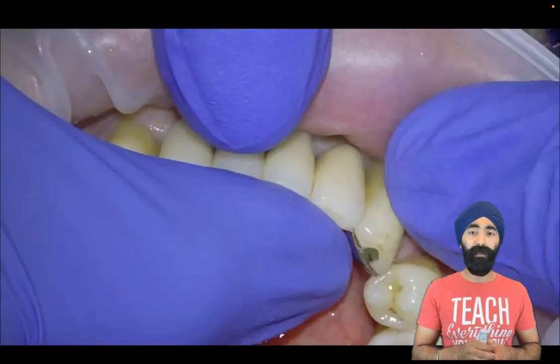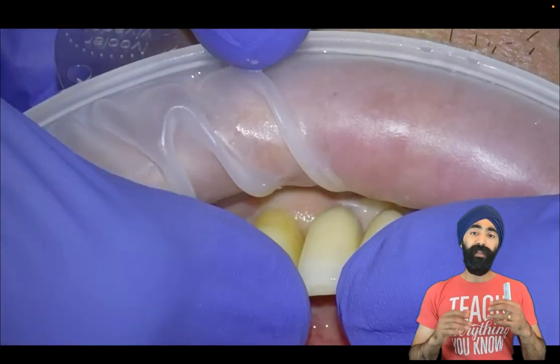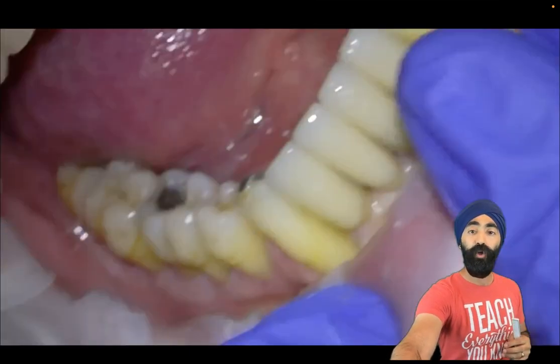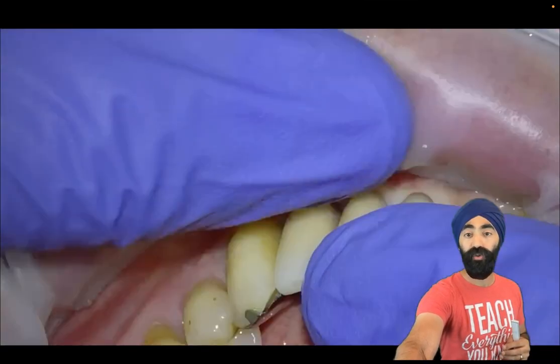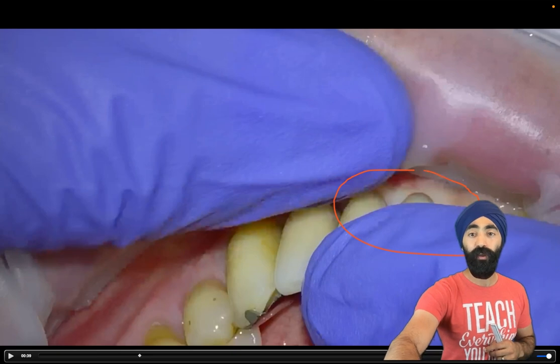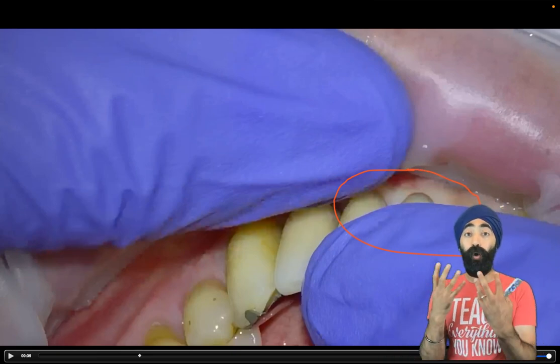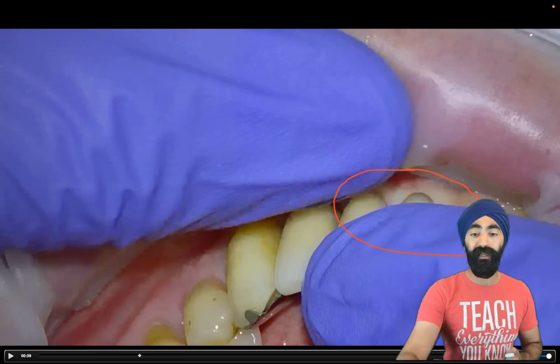I'm then going to be trying on the resin bonded bridge. You'll notice that actually there's a gap. The gap exists because we're not able to seat the bridge all the way because the soft tissues are in the way. Focus on just this area here because that's where you see the blanching of the gum. The gum starts to go white — it starts to blanch — because that's where too much pressure from the pontic is going.